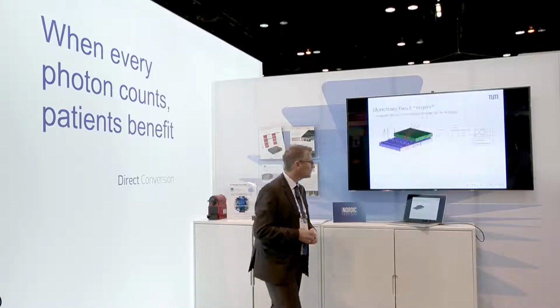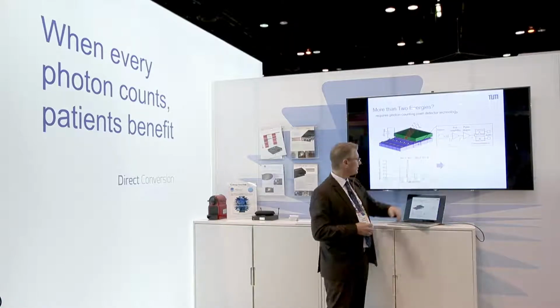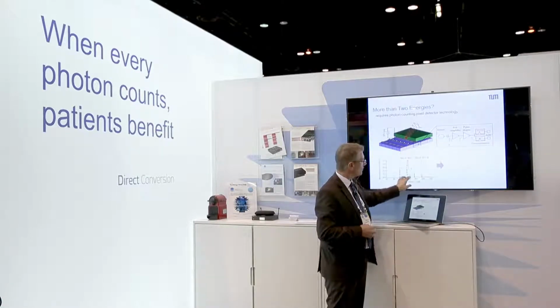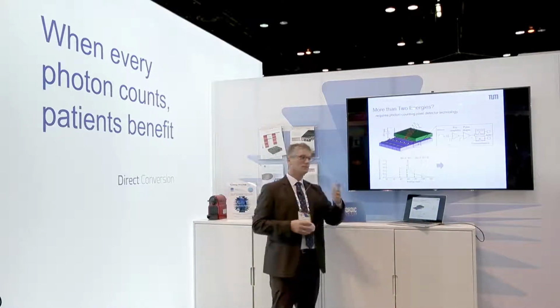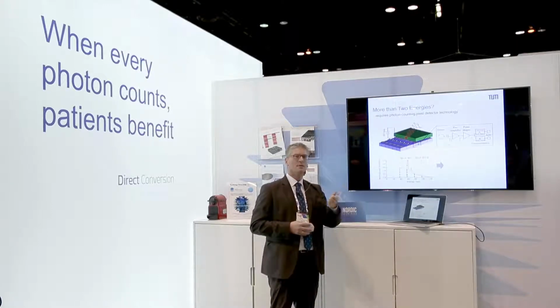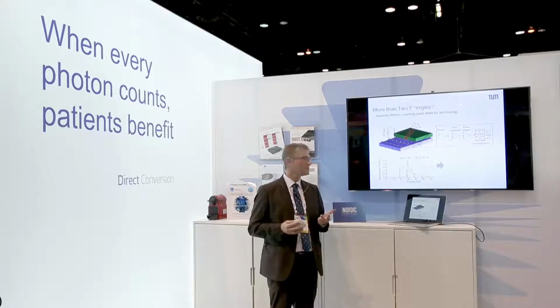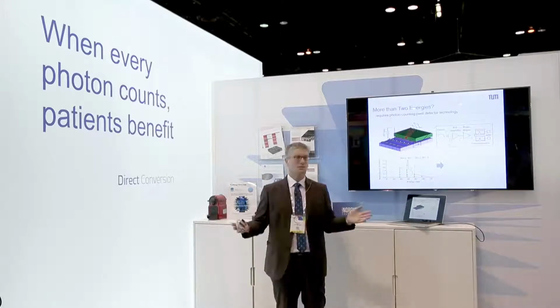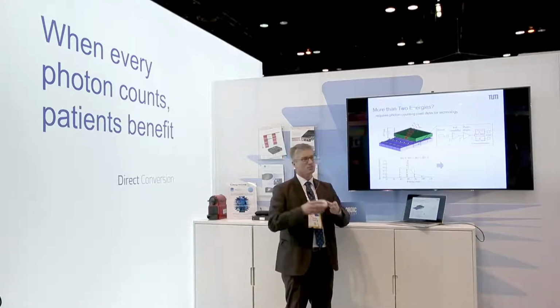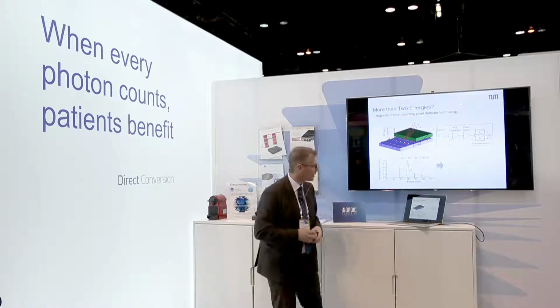So now it looks like the equation is missing here. I'm sorry. What you should see here is that with this additional information of 4 bins instead of 2, we can not only compute the Compton parameter and the photo parameter, but we can also compute additional coefficients for the different edges of different materials. So with 4 bins, we can obviously also extract 4 different materials. If we have 2 input parameters, 2 materials can be computed as a rule of thumb, and if we have 4, we can actually do more with that.